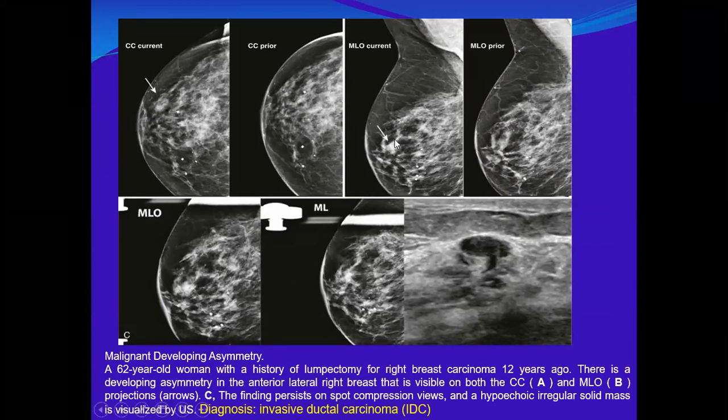And if you look at it, if you had seen the mammogram for the first time without comparing with the previous, you might pass it, yeah? Do you agree? You might say this is fine, huh? Yes, agree. Especially since it is a screening mammography. It's only screening mammography. So we just have to be aware of these pitfalls.